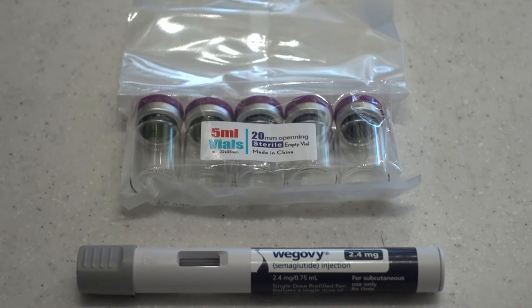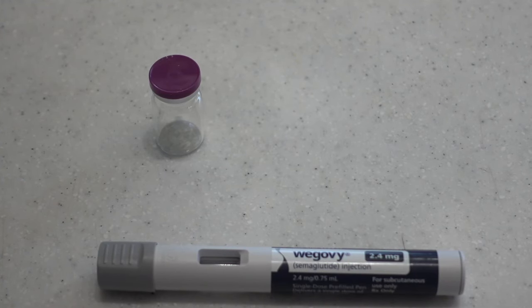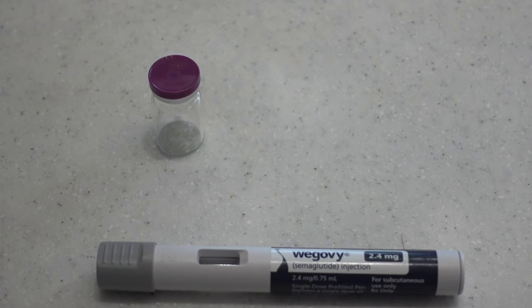This is an instructional on how to decant Wegovi 2.4 milligram semaglutide from an auto injector pen to a 5 milliliter vial. The supplies required will be a Wegovi 2.4 milligram semaglutide auto injecting pen along with a 5 milliliter vial.